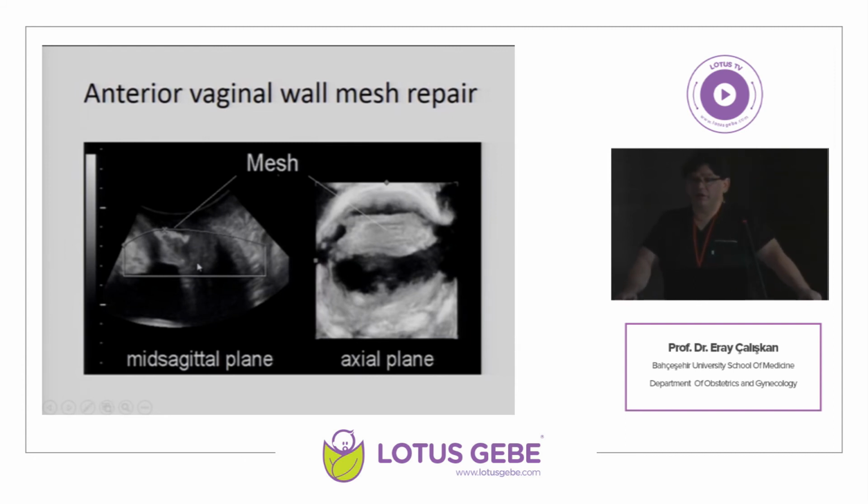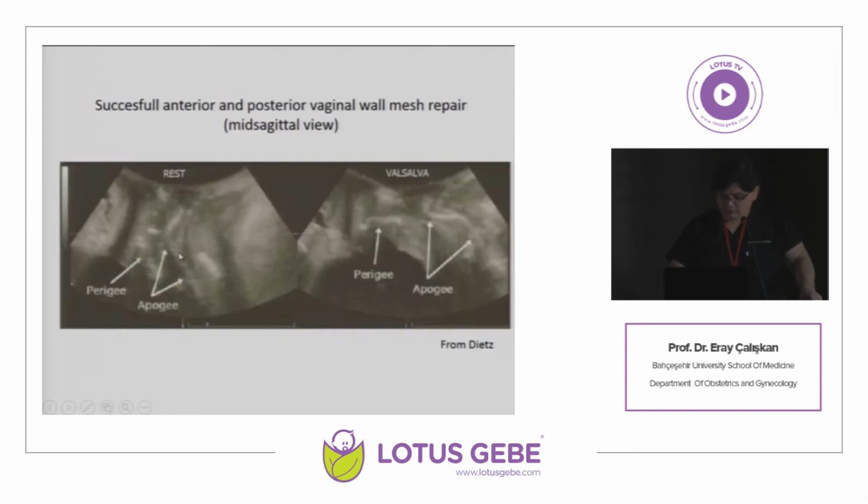There were very big meshes acting both in the mid-urethral plane and also elevating the cystocele, complete four-arm meshes. But you see the back arms of the mesh were accumulated below the urethra. It's not below the bladder.